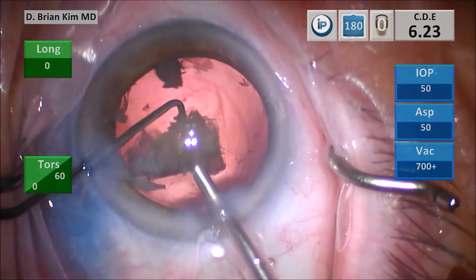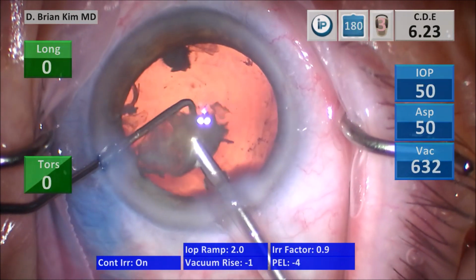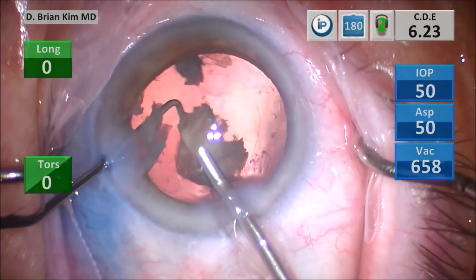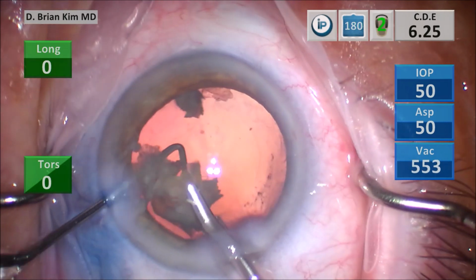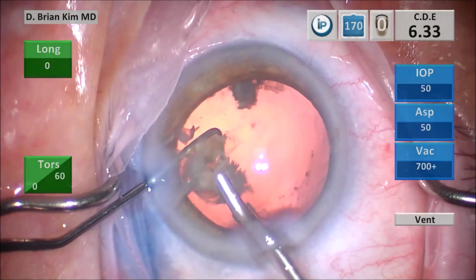So again, it's a little bit more of a challenge because I'm relying on the irrigation and just using my chopper and phaco tip to position the lens piece between the two instruments. Using a little bit of vacuum does help to position the lens piece on the tip, and then I can crush it.